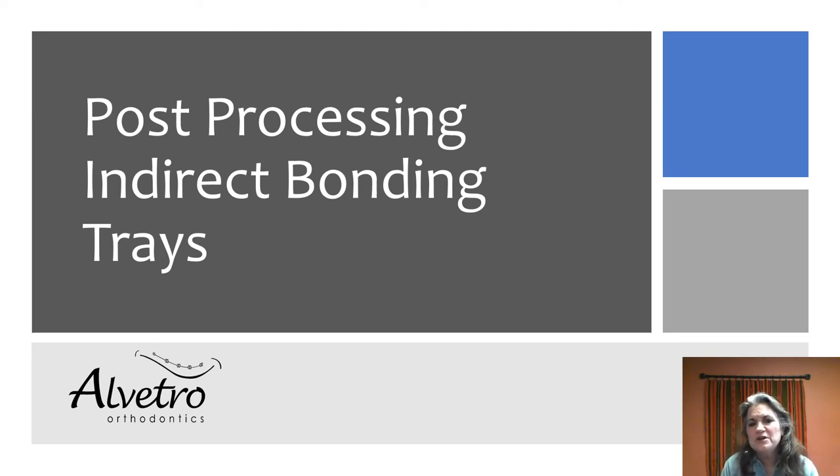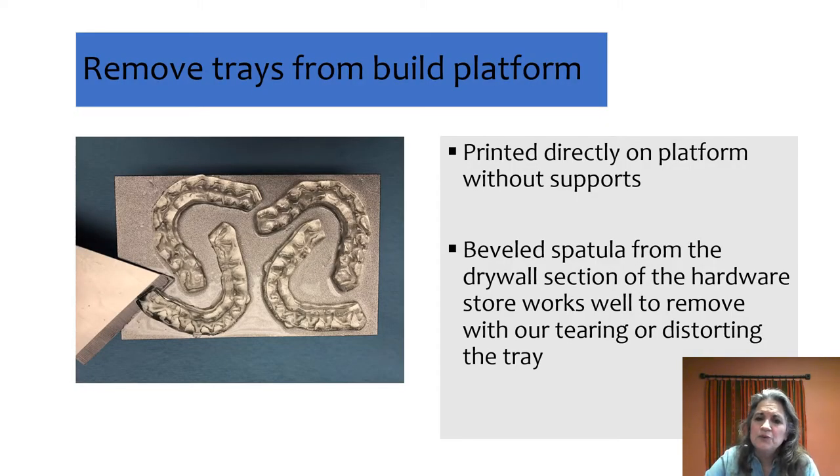I'd like to share with you post-processing indirect bonding trays. It's a very important part of being able to produce the most accurate indirect bonding trays, and sometimes there's a little bit of confusion over it, starting even from removing trays from the build platform. These were printed horizontally without supports — you can print on supports if you'd like, but we've found great success without them. We like a beveled spatula to reach underneath and peel the tray off without distorting.